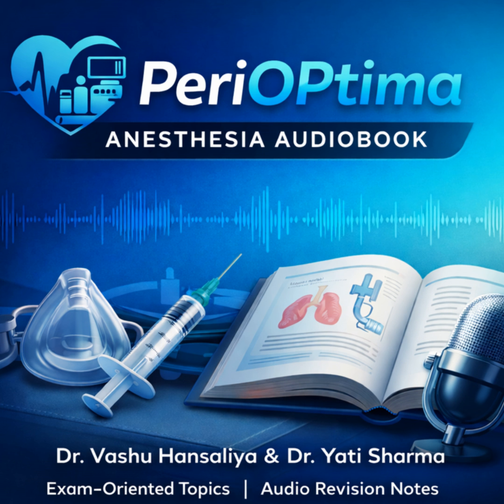So when the left ventricle tries to open the aortic valve to eject blood, it finds the door is already half open. The resistance, or what we call the afterload, is significantly reduced. The left ventricle ejects against lower resistance. Why is that a good thing? According to the law of Laplace, reduced afterload means reduced wall tension, and reduced wall tension means reduced myocardial oxygen consumption, or MVO2.